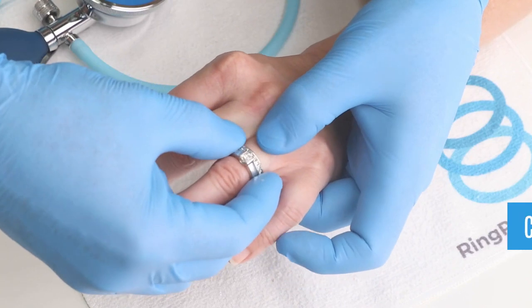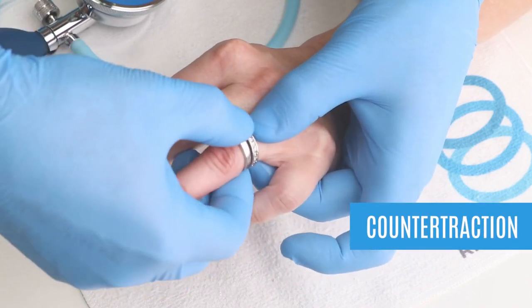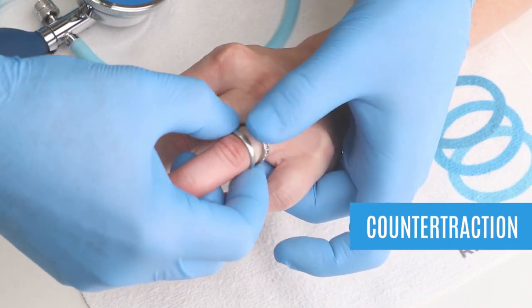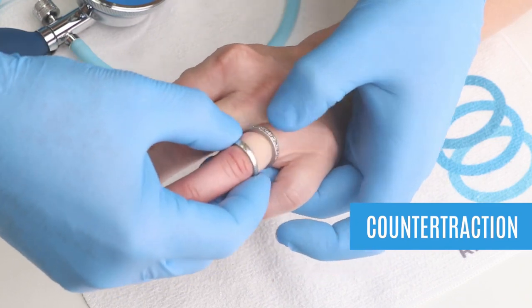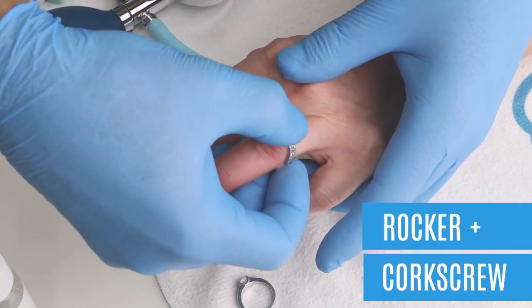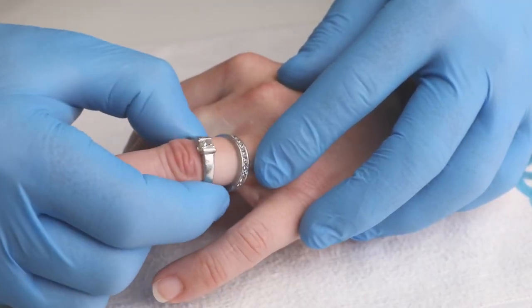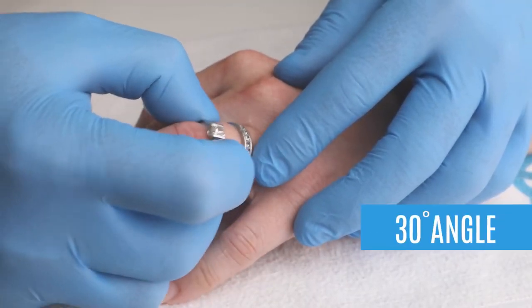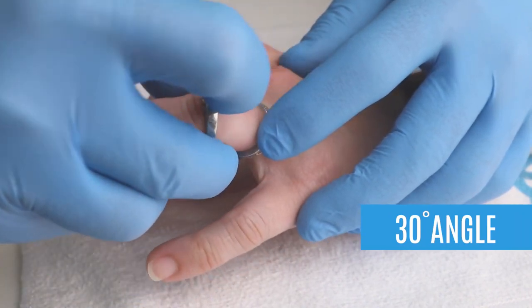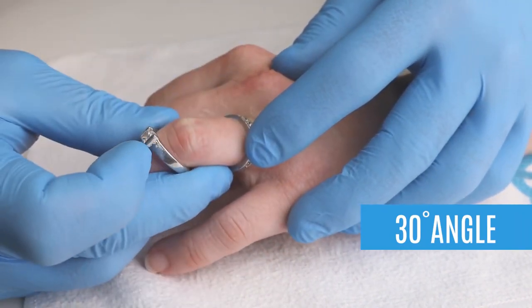If still meeting resistance, use counter traction with your non-dominant hand to pull the skin back towards the base of the finger, while slowly progressing the ring off while using the rocker and corkscrew techniques. If over the knuckle and you're still just hung up on that last bit of skin, have the person bend at the knuckle to a 30 degree angle. It changes the angle and stretches the skin to help you get the ring off.